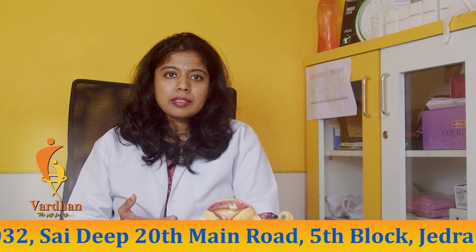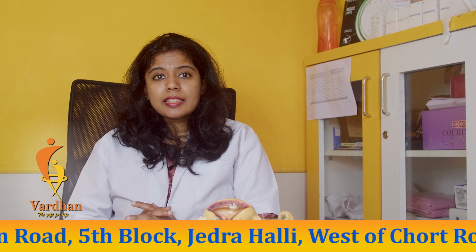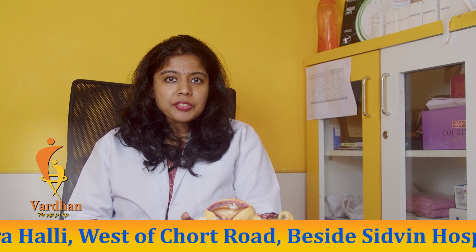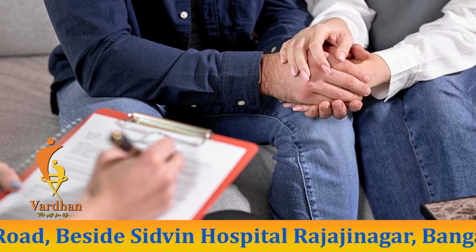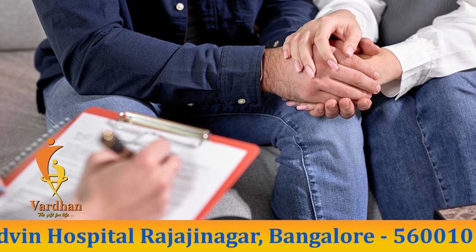And so how do you prepare for this test? Like I told you what is going to happen in the test, since you may experience some discomfort, and I know there is a lot of anxiety associated with this test, it's better to go with someone, not alone. Be mentally prepared, not be very stressed out before the test, have food, and take your painkillers on time. And best is to have complete information about what you're going to go through. This will help you to deal with the test better.